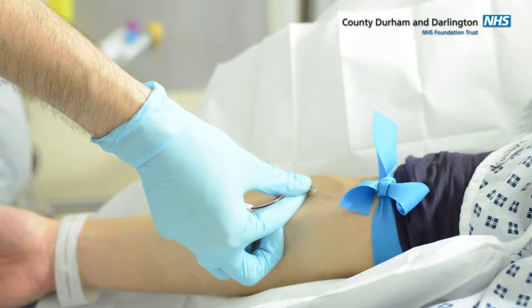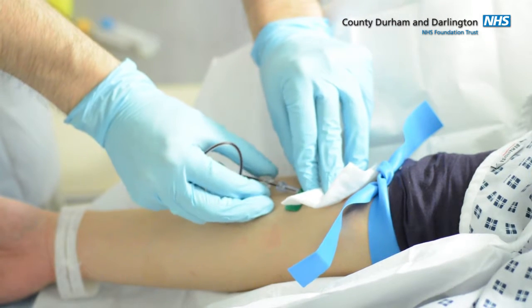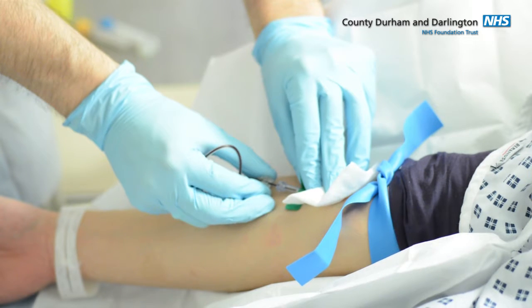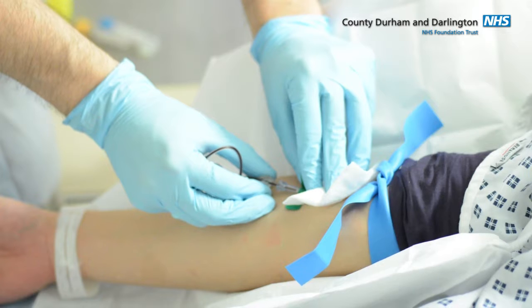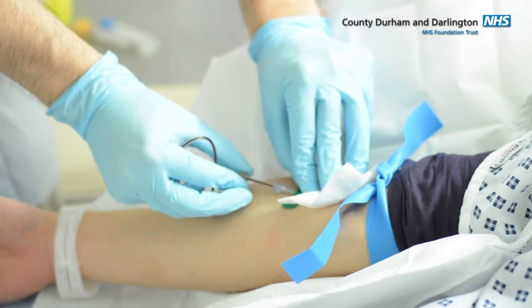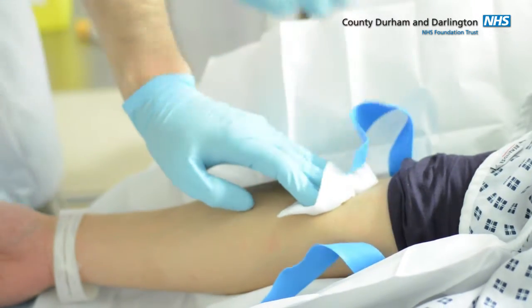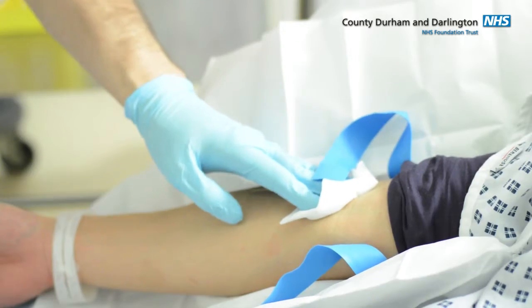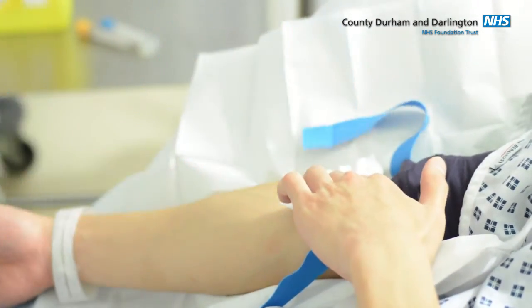That should be fine. Once the samples are collected, activate the safety mechanism of the safety butterfly and place directly into the sharps bin. And that's fine. Do you mind pressing here for me, sir? Thank you.